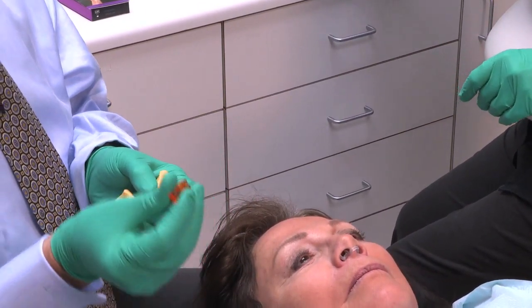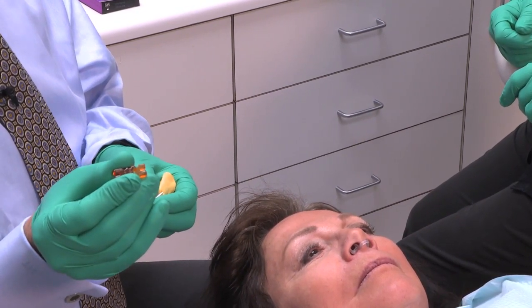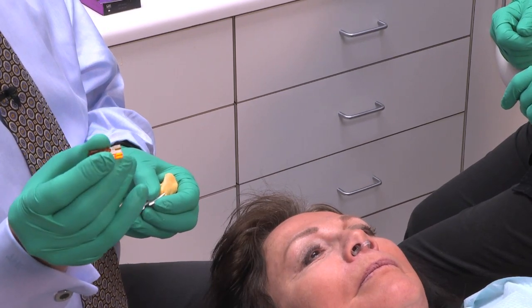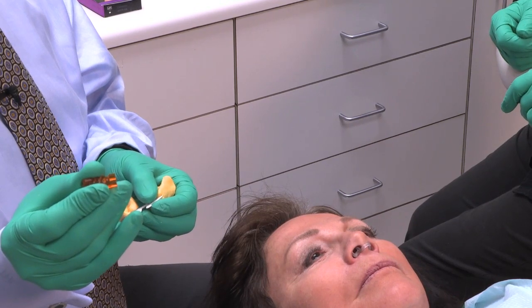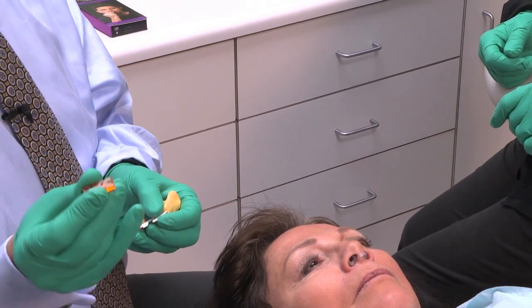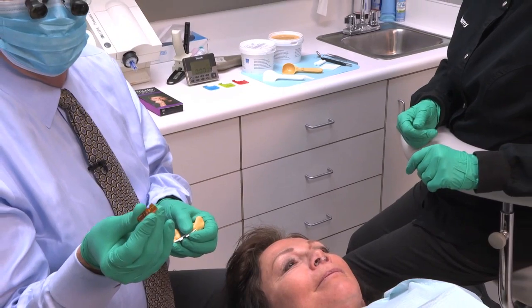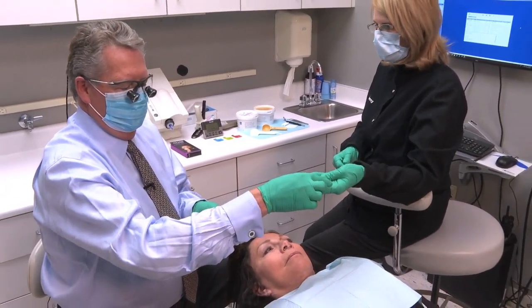The key comes off and stays behind and gets cold sterilized. Do not autoclave these pieces. They're made out of plastic. If you autoclave these, you will end up with a nice piece of melted plastic that will be a nice piece of artwork you can display on your cabinet. So cold sterilization only. Do not autoclave.